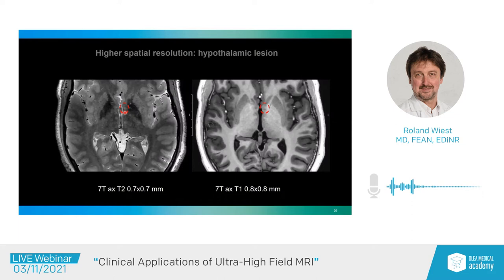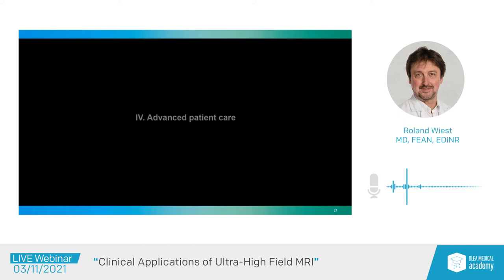So it is in some cases really helpful, especially in rare disorders or in small lesions like in the brainstem or the hypothalamus, to help with the detection of subtle lesions that may cause certain disorders that you would not expect previously. With that, I would like to come to our first experience with advanced patient care.